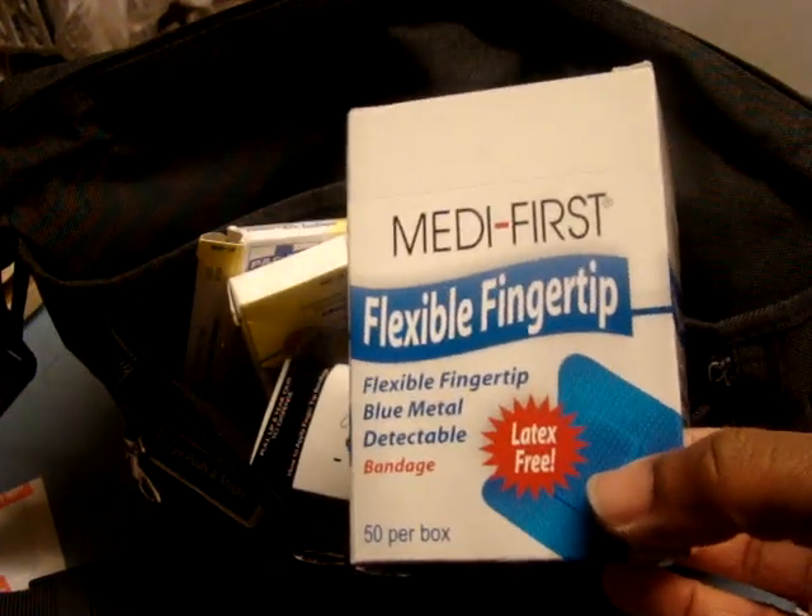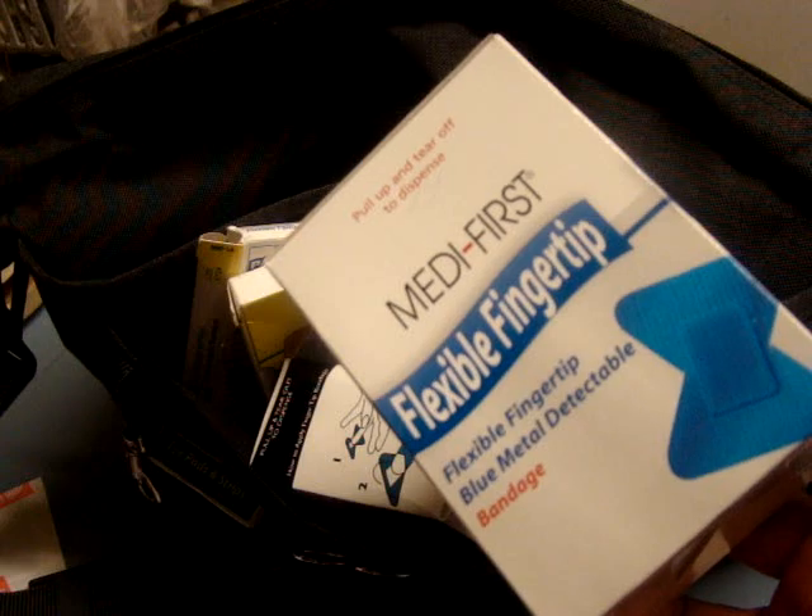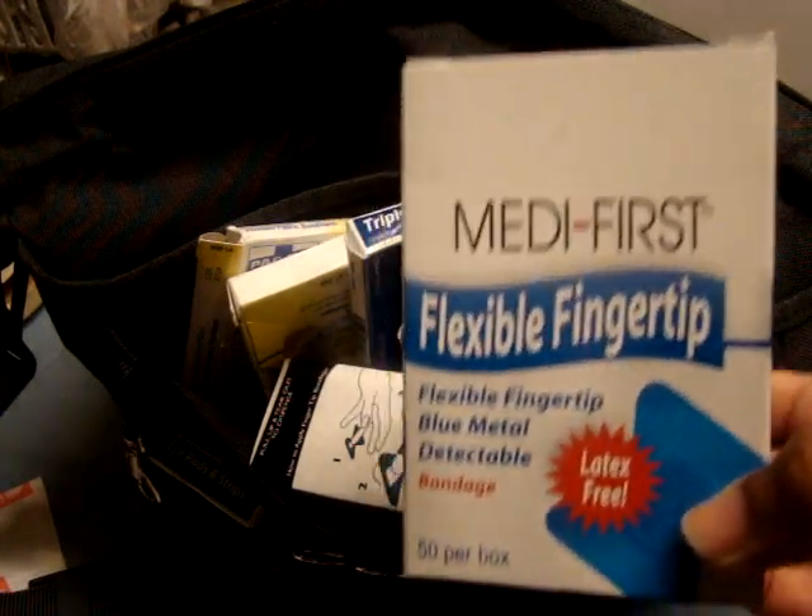My mission is I'm trying to buy everything — all the first aid stuff that Webster Run is actually selling — so that I can be able to make my own homeschool first aid kit bag.